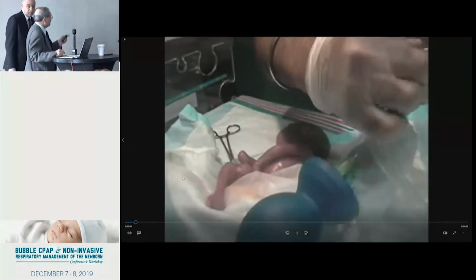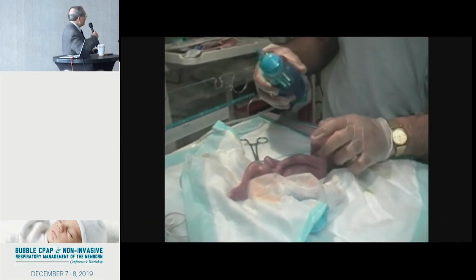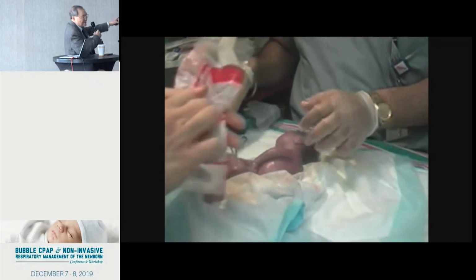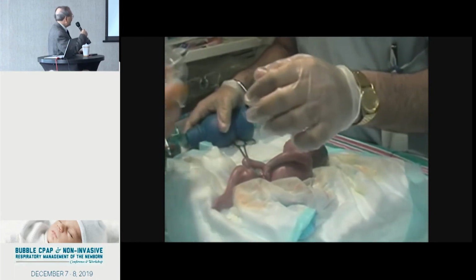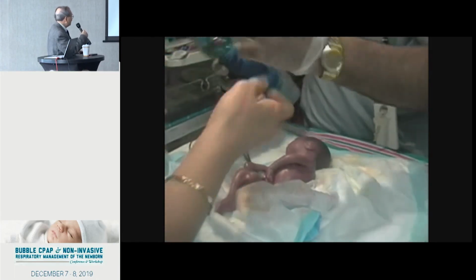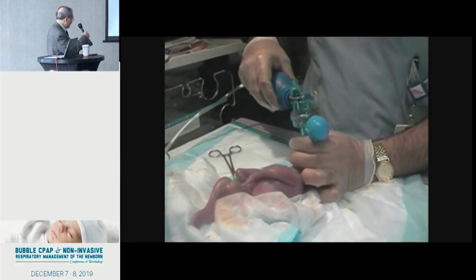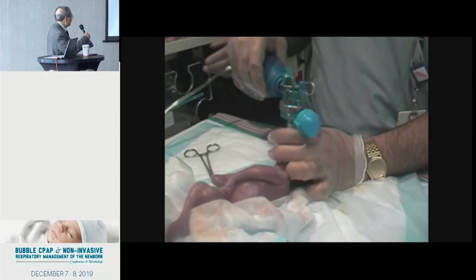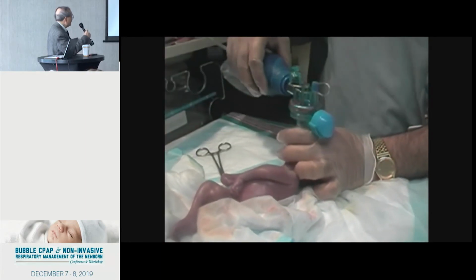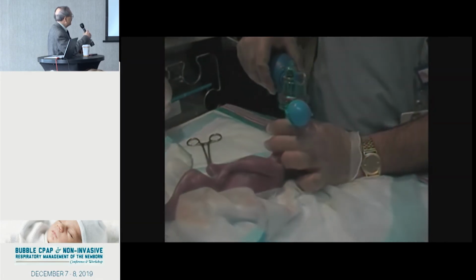Okay. So this baby, precipitate delivery in bed. So the obstetrician dropped this to us. His APGAR score is 1. Okay, so he needs to be resuscitated. And when you resuscitate, don't just put a mask and ambu. You have to make sure of the chest excursion. She doesn't respond. I'm the one taking the video. See? So I took over.